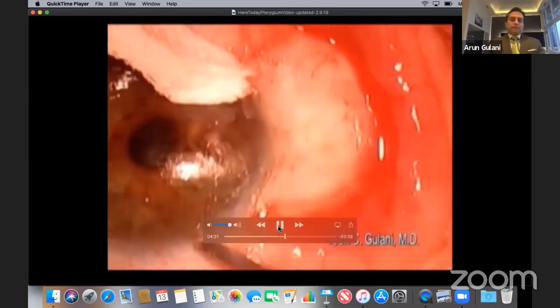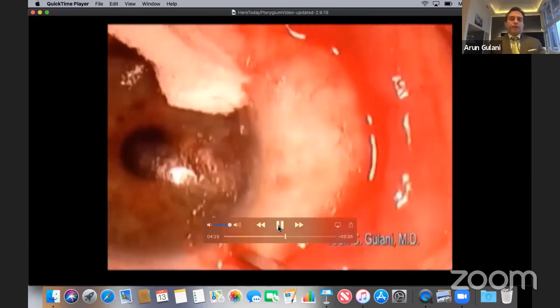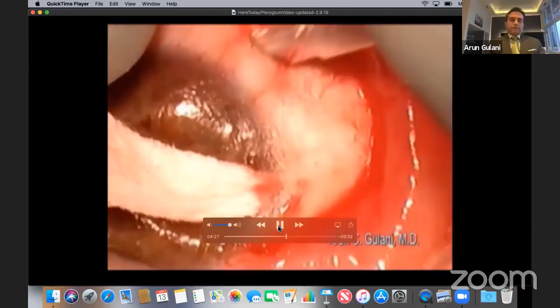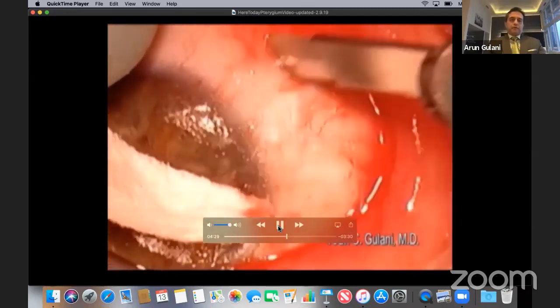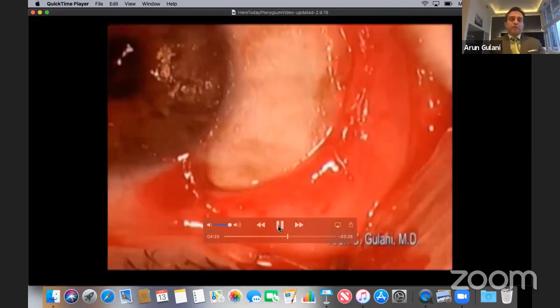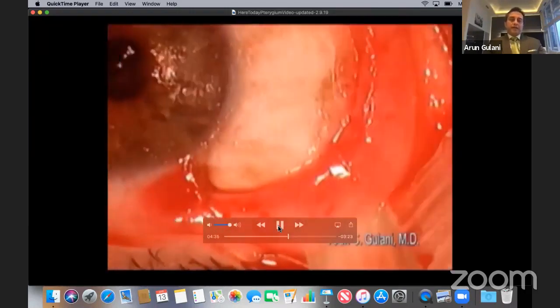Using a 64 blade, smoothen the cornea, the limbus, and the episcleral area. Once again, used as an eraser, fast, smooth movements of the blade to smoothen the entire junction. Literally none to minimal cautery for very preparation for the amniotic graft. None to very minimal cautery. Very important. Use the blade to clean the area for any excessive tissue.